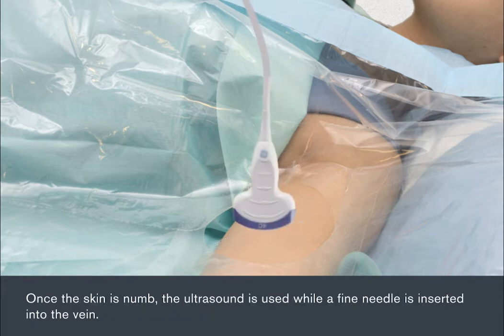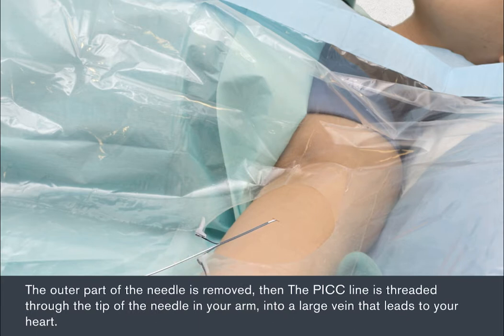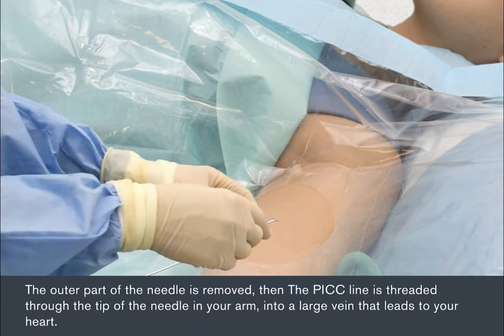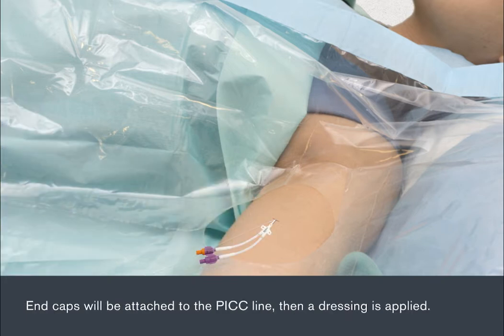Once the skin is numb, the ultrasound is used while a fine needle is inserted into the vein. The outer part of the needle is removed, then the PICC line is threaded through the tip of the needle in your arm into a large vein that leads to your heart. The insertion is usually painless and takes only a few minutes. End caps will be attached to the PICC line. Then a dressing is applied.